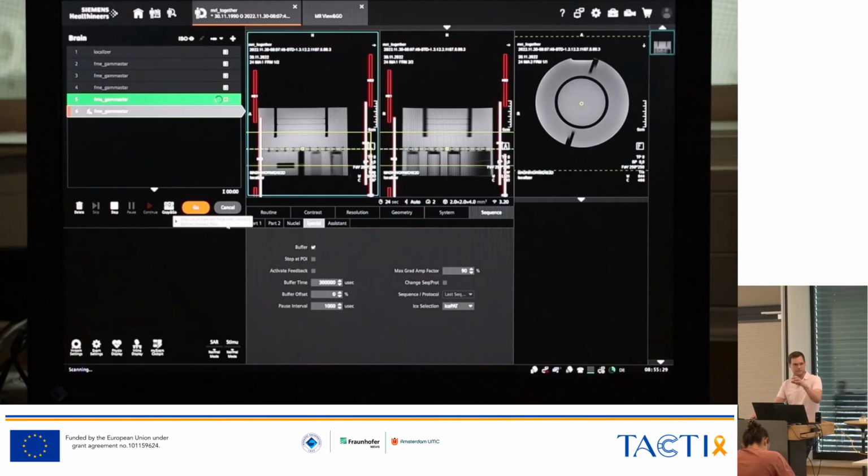So you would press the button to run the sequence, and then you would wait for 30 seconds, maybe 1 minute, and then the acquisition would start, and you really don't want to do that. So it should start immediately with the first events in the MR sequence, and then while running, the sequence should calculate all the remaining hardware events.